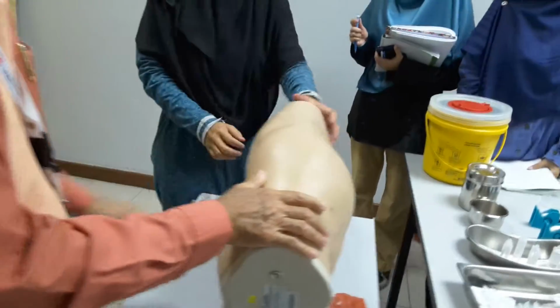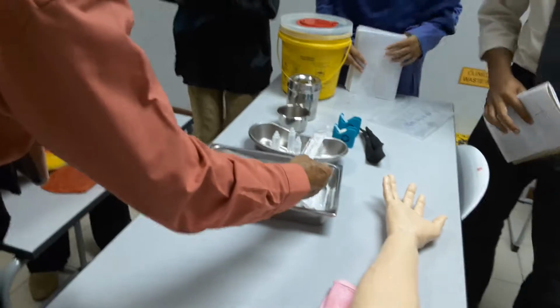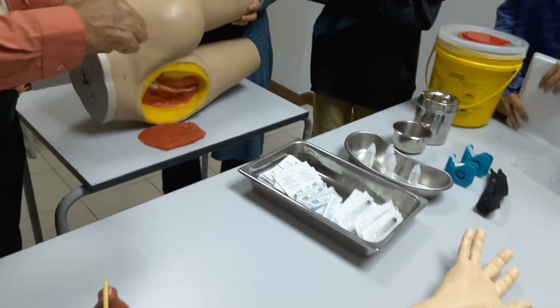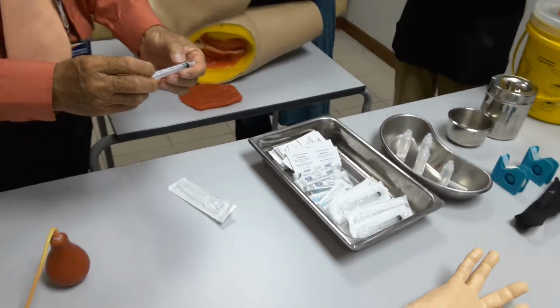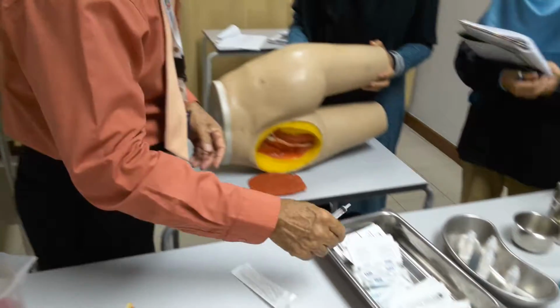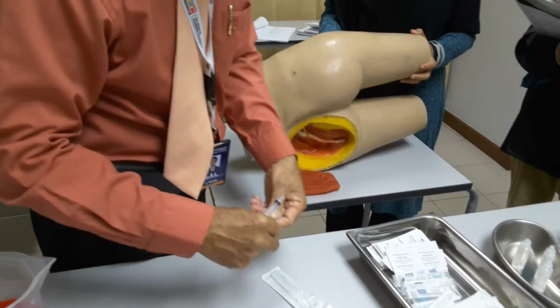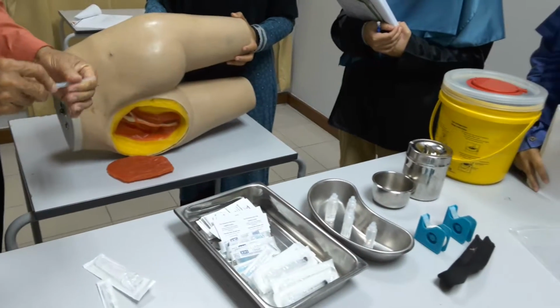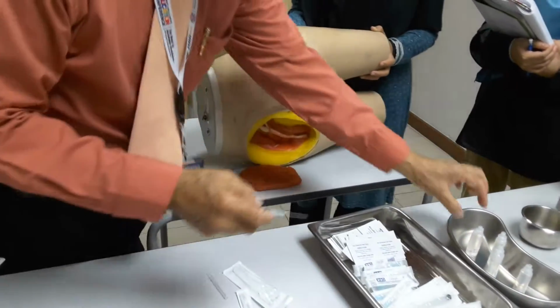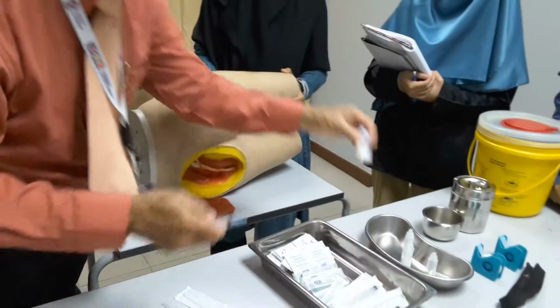Okay. Now before that, we have all the equipment here. So usually we use something like a 5 cc syringe. Now this one is 3 cc, never mind. Usually, size 23 needle is the best. We have to wash our hands, put on the glove, and then put on the needle. If it is easy to suck, it's alright. We can still use the sucking needle. Okay, I'm going to suck here.